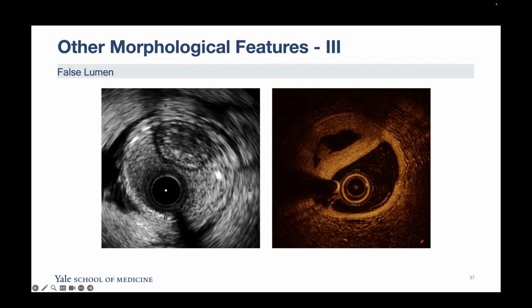Just have this memorized. You'll see it a lot this year in your CTOs, but there will be non-CTO cases too, and it's very important that you can make that distinction, because if you can't and you then stent, it's more or less an irretrievable catastrophe.